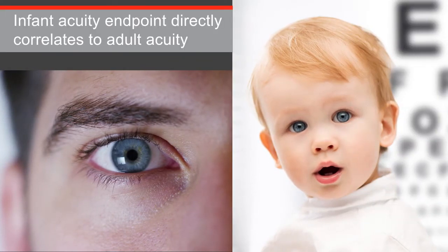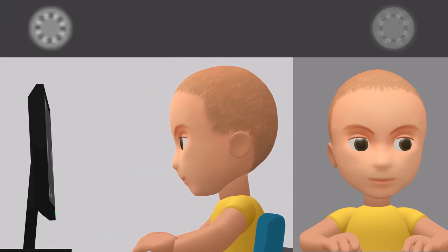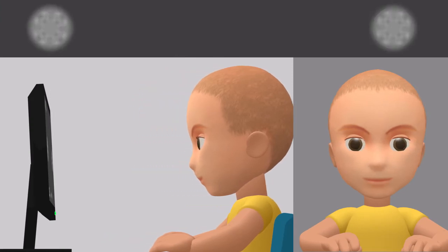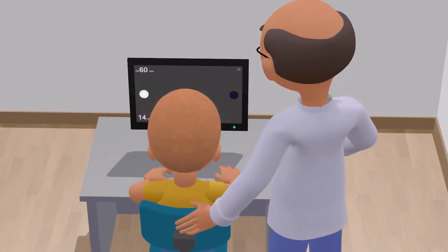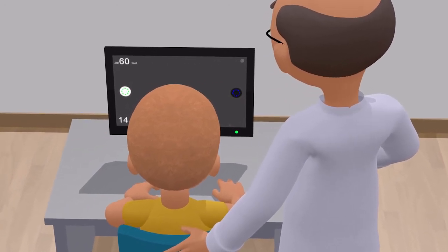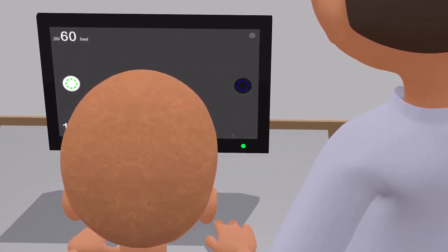The infant acuity endpoint directly correlates to adult acuity. You can validate that acuity endpoint by moving the child away from the monitor to see if they lose the ability to track that rotation, or by moving the child closer to the monitor to see if the child can again detect rotation of that smaller DIOP.